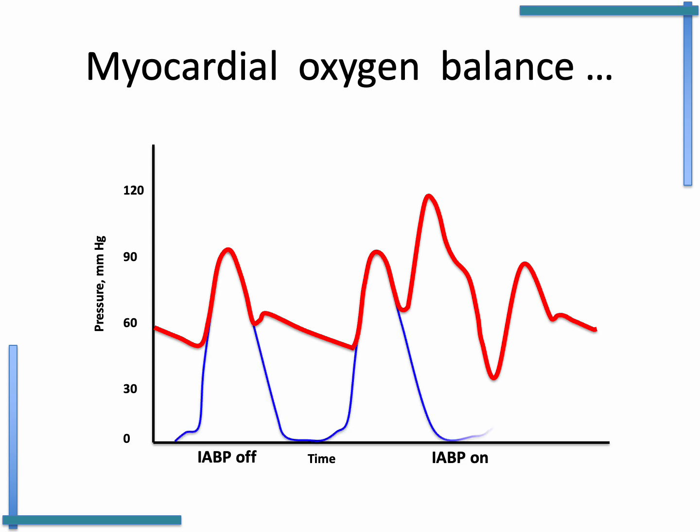And if we look at what we know from physiology, we can look at the area under this arterial line trace, and we know that part of this area is related to ventricular contraction. In fact, we can describe this area here in the orange as the systolic tension time index, and that's a period of time during which the ventricle demands oxygen and consumes it.